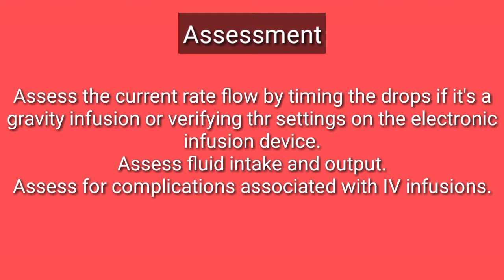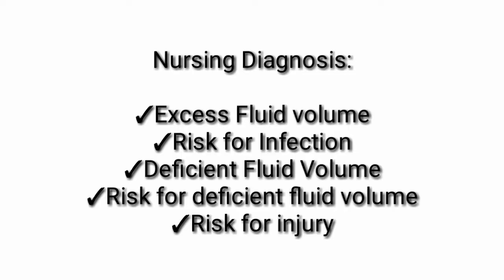Assessment. Assess the current rate flow by timing the drops if it is gravity infusion, or verifying the setting on the electronic infusion device. Assess fluid intake and output. Assess for complications associated with IV infusion. Nursing diagnosis: excess fluid volume, risk for infection, deficient fluid volume, risk for deficient fluid volume, risk for injury.